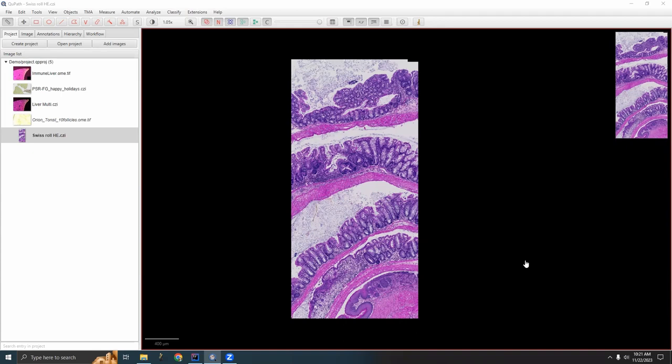All right, I have one more example here of a script that can make your life a little bit easier and save you some time. This script is a little bit more complicated than what we've done before. In total, what we're going to do is make some regions, name them, and export them so that you could view them in other programs like PowerPoint. The script is composed of a couple of different parts, each of which individually I end up using pretty routinely for other purposes. So let's get started.